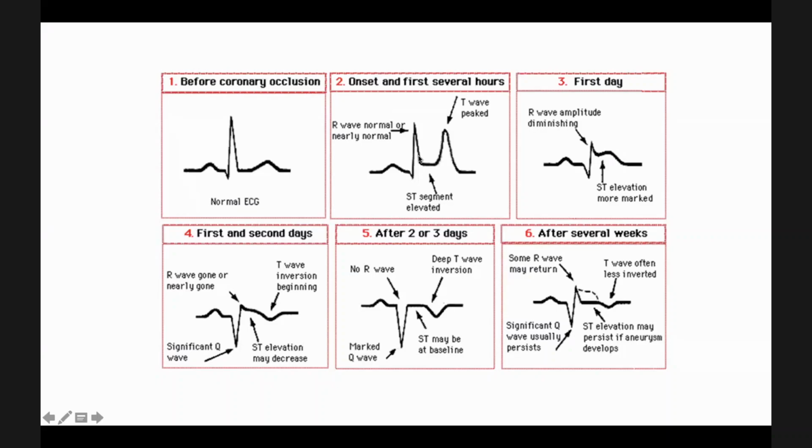The patient came early to the hospital, but you diagnosed the ST elevation MI late. So it's not a late presentation, but a late diagnosis. Because of that, it's very important: if you see hyperacute T waves, you have to repeat the ECGs hourly until you see the ST elevation, and then quickly do primary PCI or give thrombolytics.